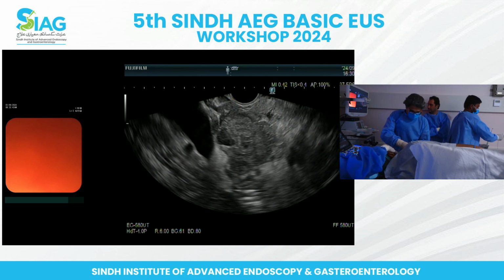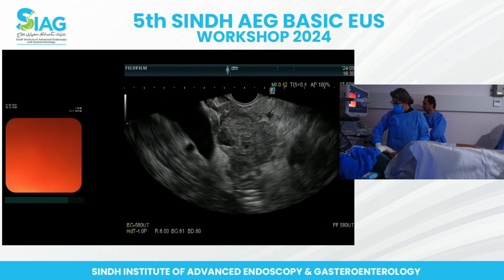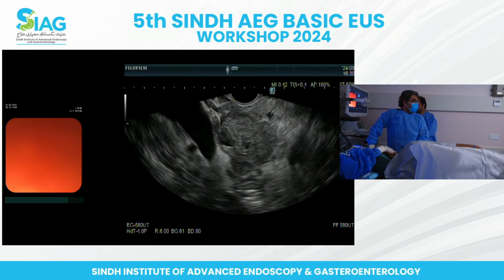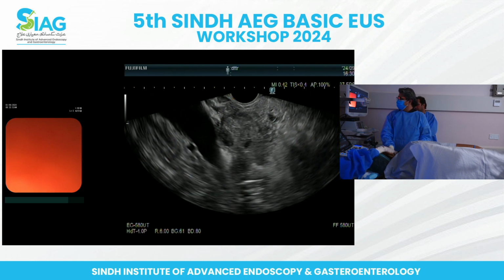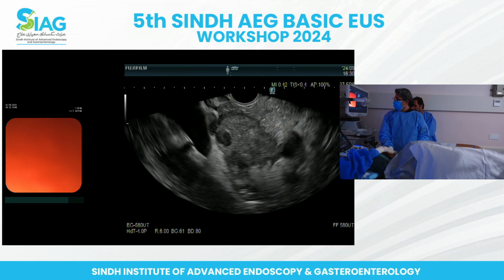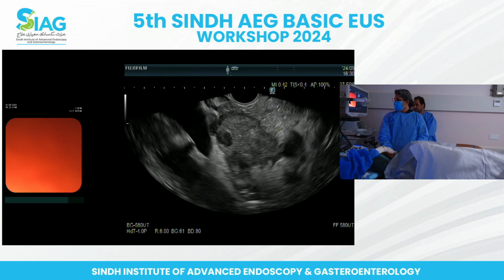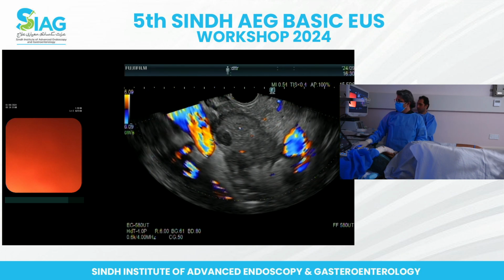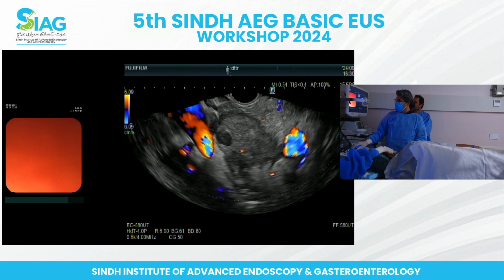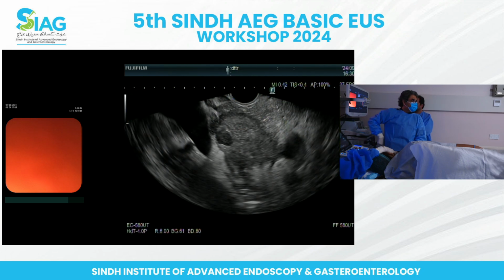Thank you. So we'll stay in this position. We'll wait for the Rose team to tell us if there are any cells. The sheath is not going to do anything except push the lumen wall away from you, and you don't want to push the sheath too much because the needle puncture closes very easily. If the sheath punctures the wall, that could be more problematic.